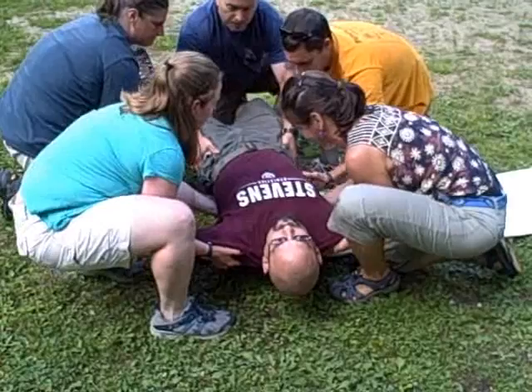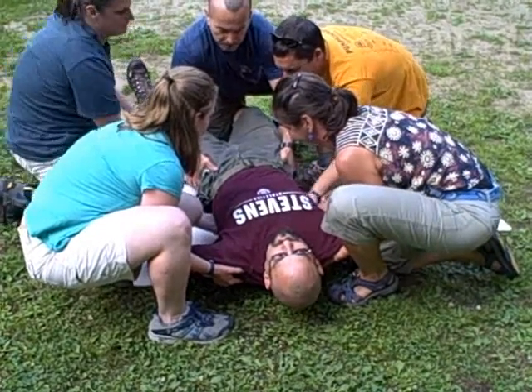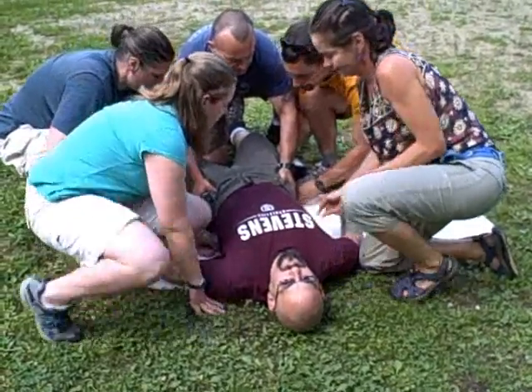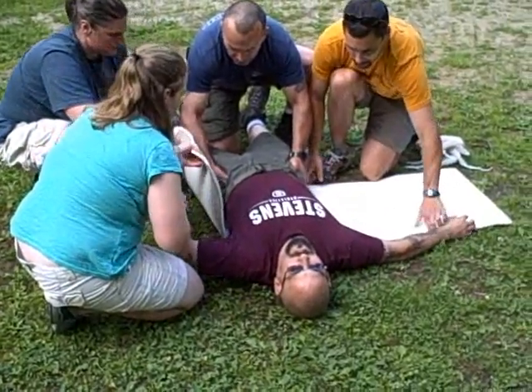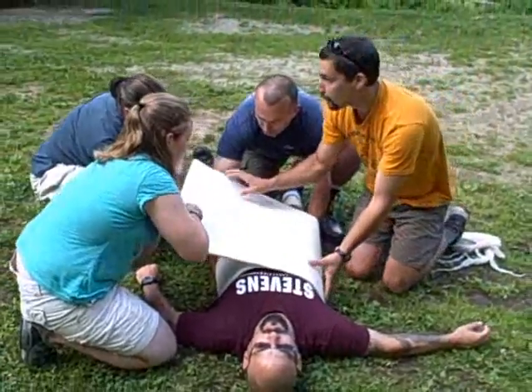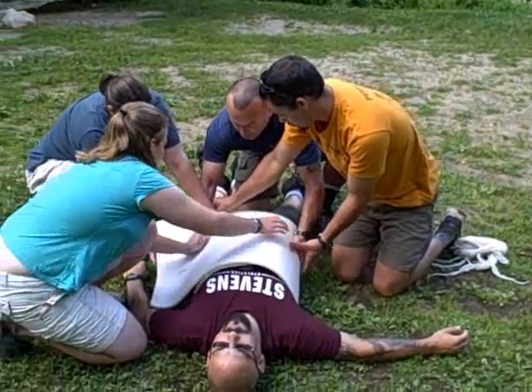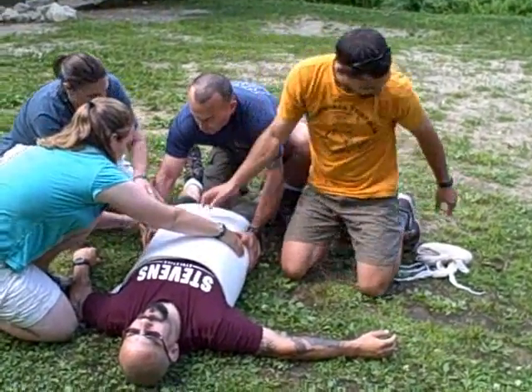Straight up. I'm going to slide this pad right under. One, two, three — down. The whole time Ivan's holding that pelvis closed for us. I'm just going to bring your arm up to the side there for a minute, Jerry. So we're going to wrap this pad right up around the pelvis here. Slide those hands right out and hold them. Perfect, Ivan.